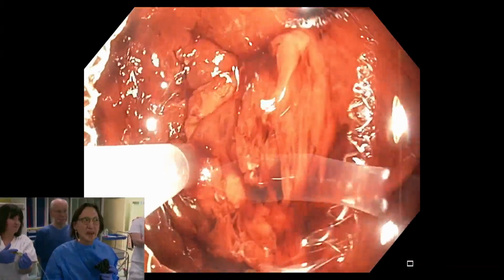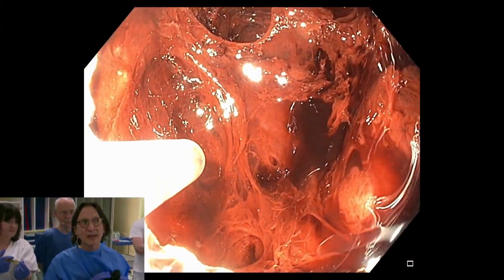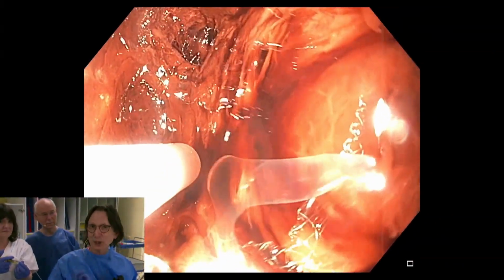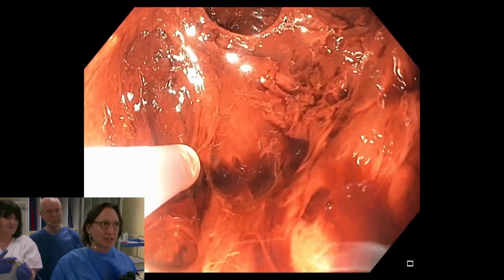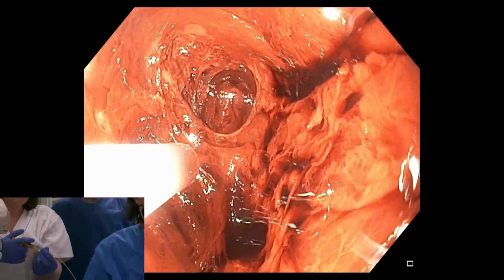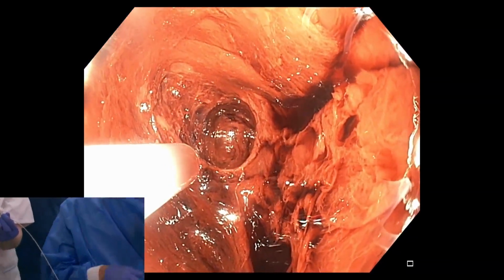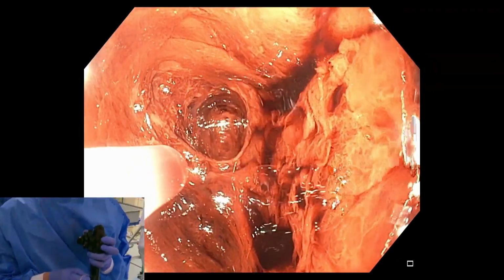And I've used this a number of times in patients with bleeding from pseudocysts or walled-off necroses, because remember, a pseudocyst has a pseudo wall, and the wall is lined with blood vessels. So you don't want to go in there with hot biopsy forceps or any coagulation devices. Purostat is really the ideal solution. So you should have this available in your unit when you're doing this.